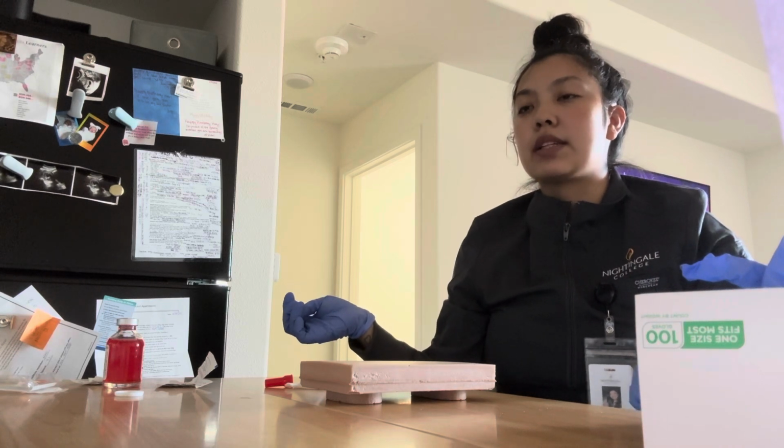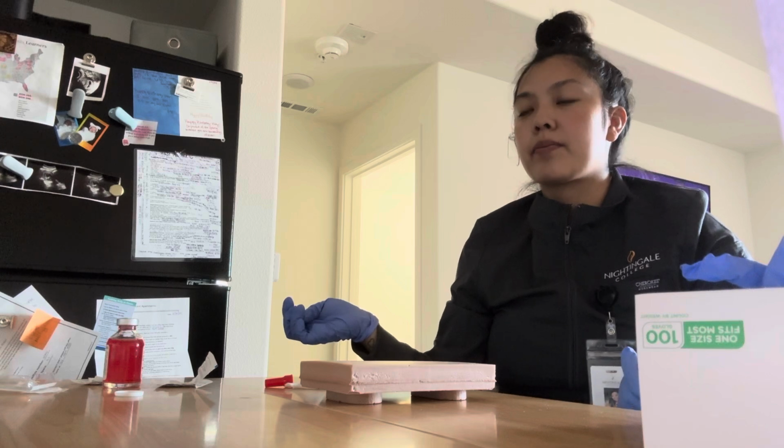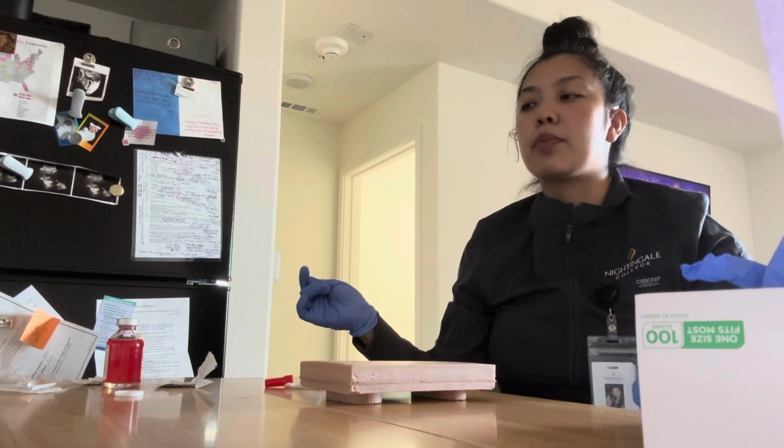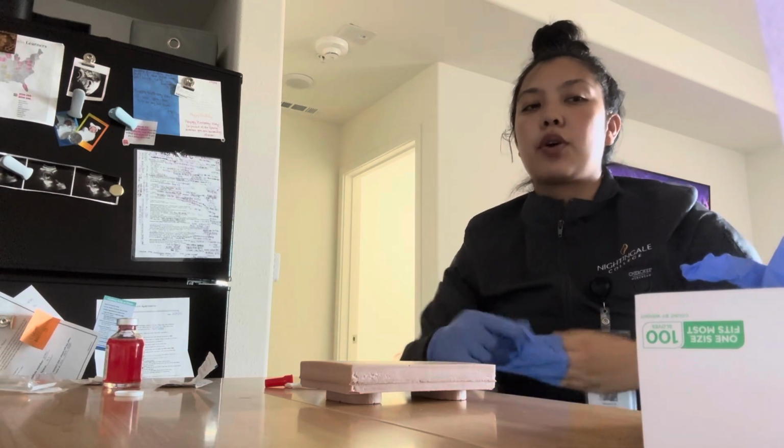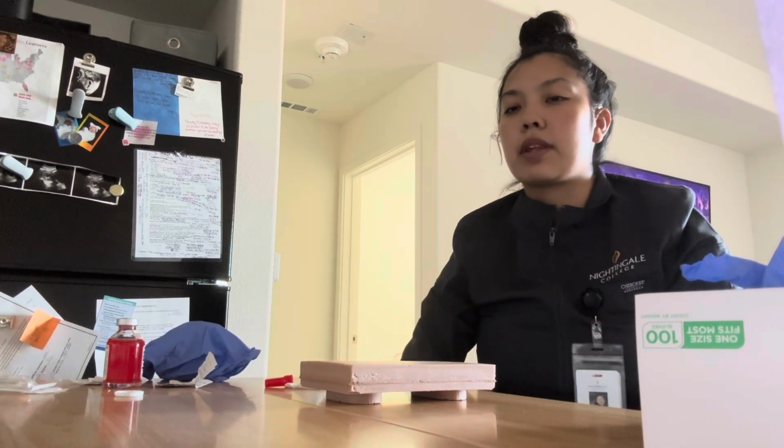And then I'm going to ask the patient if they're okay. Are you comfortable in doing okay? Perfect. Okay, I'm going to go ahead and clean up all my supplies. I am going to take off my gloves, discard of that, hand hygiene, and document the procedure.